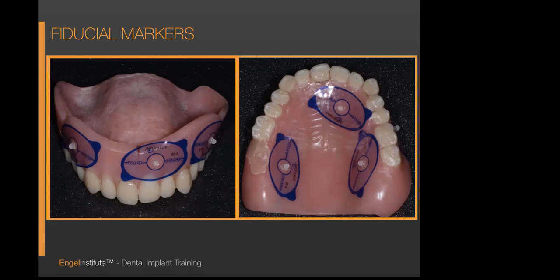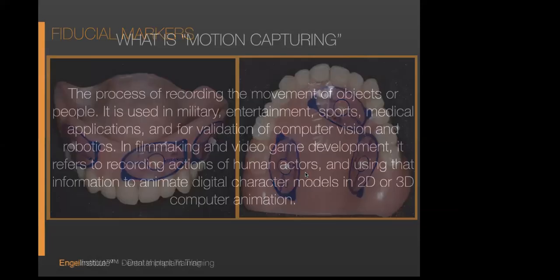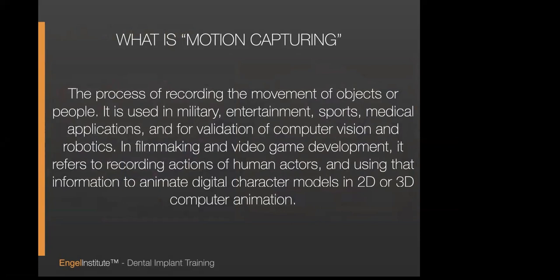So question is, what if you are doing upper and lower? You can scan the patient wearing both of these prostheses when you scan them with their teeth. And then when you're scanning them alone, that is 2 separate scans. That is 1 for each arch, okay? Much like a regular patient. So the dry scan first, then we're going to scan it with the patient wearing them.